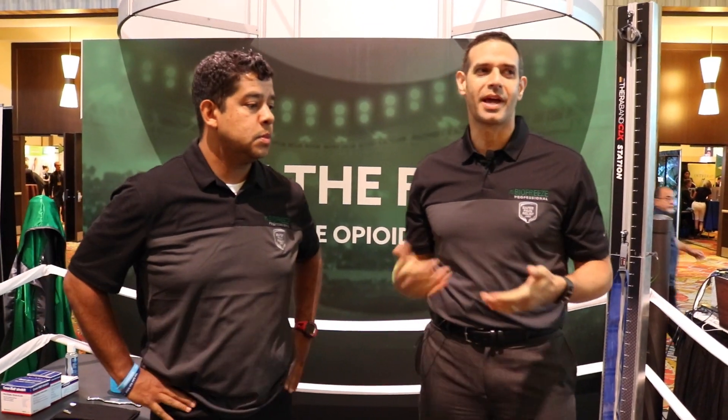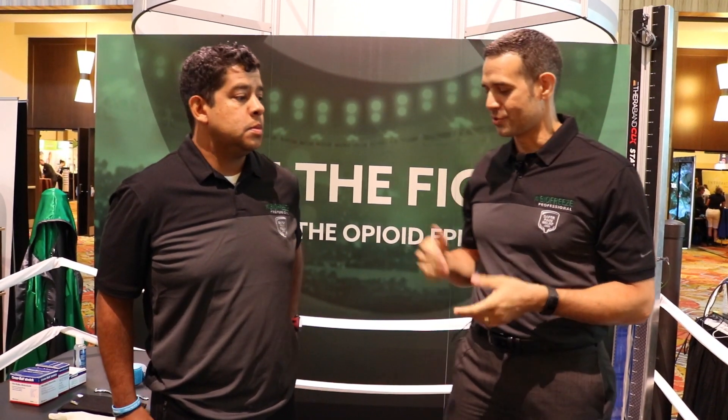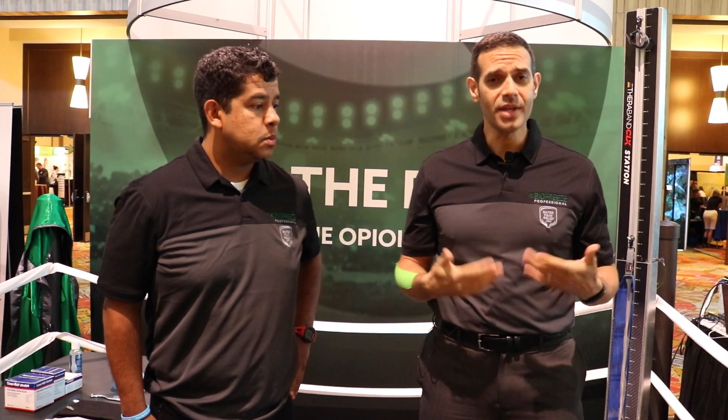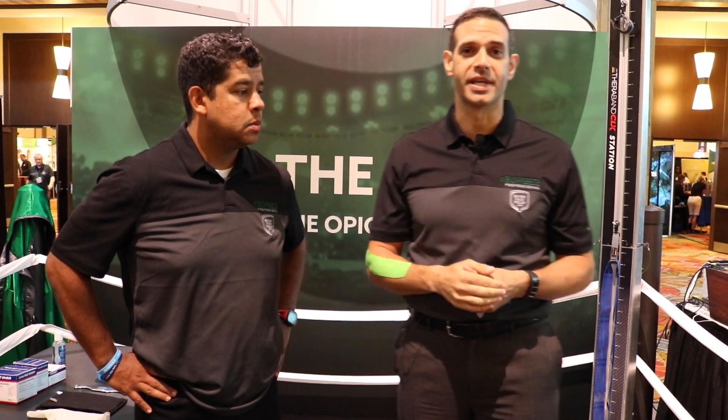Good morning Orlando! We're going to go through a myofascial treatment for somebody who might have an osteoarthritic knee, or we can use these same techniques for somebody with a patellar tracking disorder. We're going to go through some soft tissue techniques as well as taping techniques, and we'll do a progressive taping based on how significant the symptoms are and how much relief the patient gets.